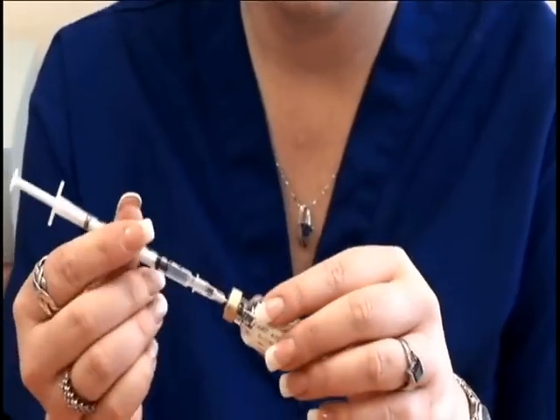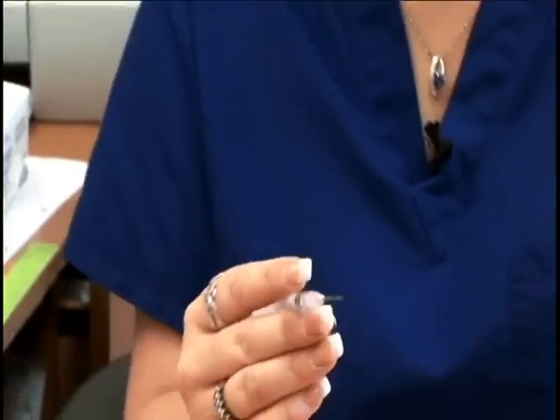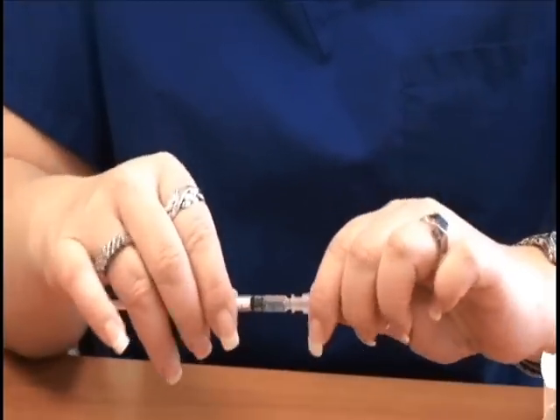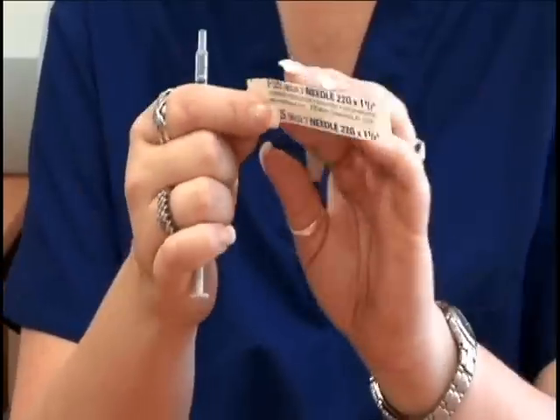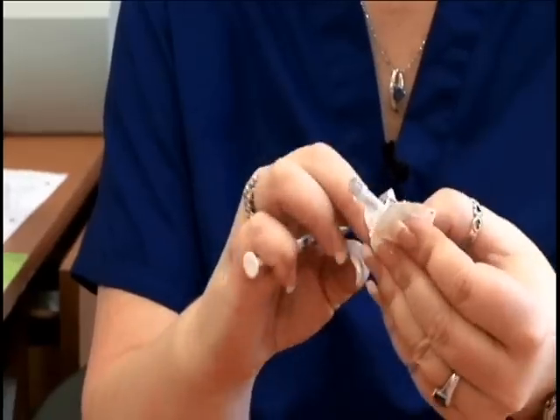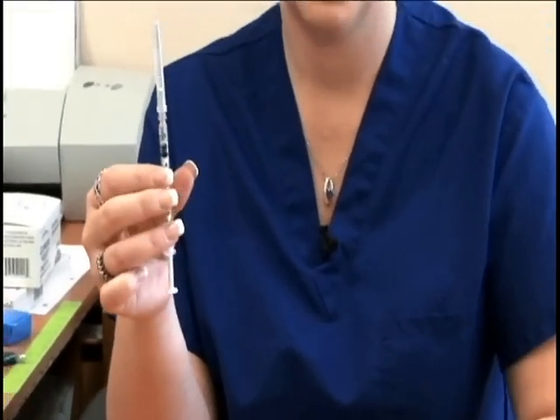You will then remove the syringe and remove the large needle. Now open up the 22-gauge 1½-inch needle and apply it to the syringe. Now you're ready to give the injection intramuscularly.